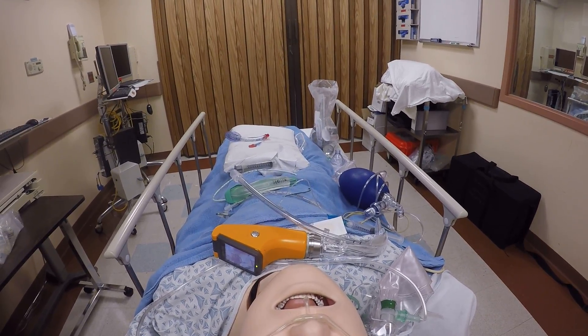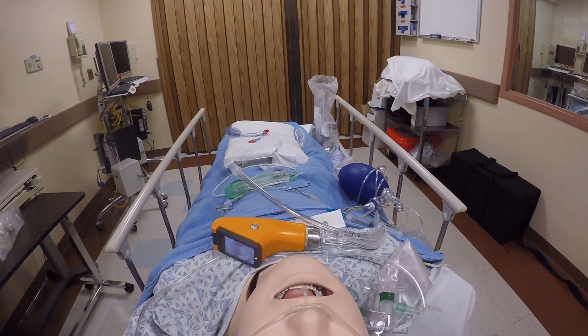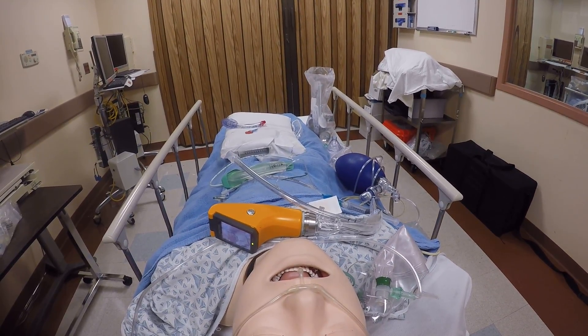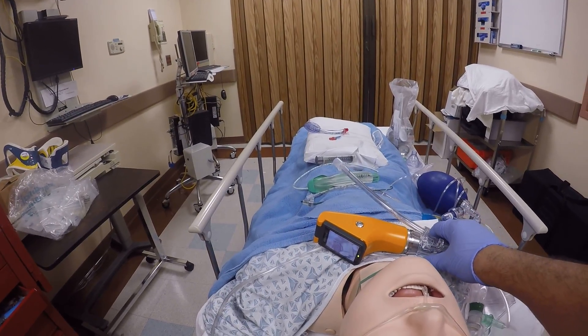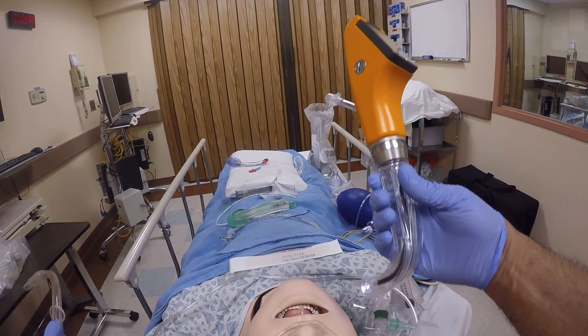Welcome back. Does gastric diversion work? I think it does. Does it work with other channel devices? I've demonstrated in the past with the King Vision that it does, and I think it will work with an AWS device too. Please disregard the phone. I have my AWS ready.